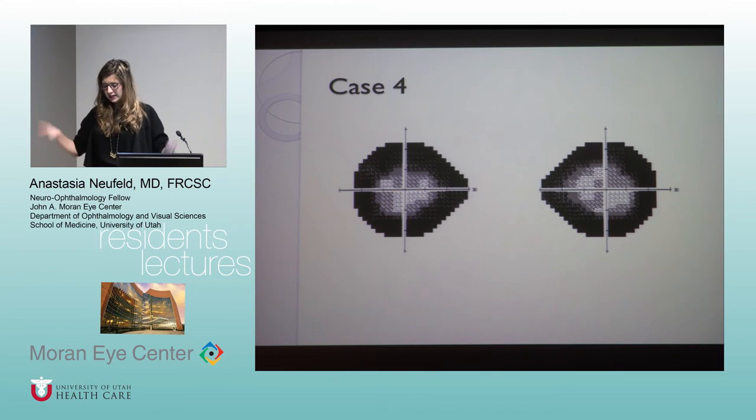So again, maybe pattern recognition. So it's a 24-2 visual field, and she's got kind of bilateral generalized constriction. Mm-hmm. Anything else you can call this? Keywords? Central island? Yeah, I mean, we call this a ring scotoma. Okay, so basically it's a scotoma that's centered on the visual axis or the visual center.